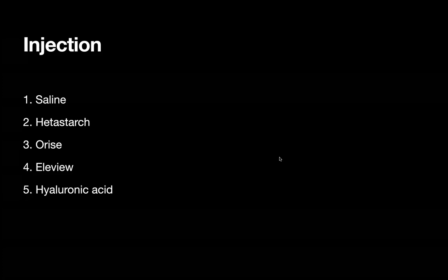I prefer to use saline, but when you use saline, you want to make sure that you have everything set up right. The connection to the electrosurgery unit is set up. You have picked up the snare that you want, and as soon as you inject saline, once you're happy with the elevation, you should not waste any time. You should be ready with your snare to cut.